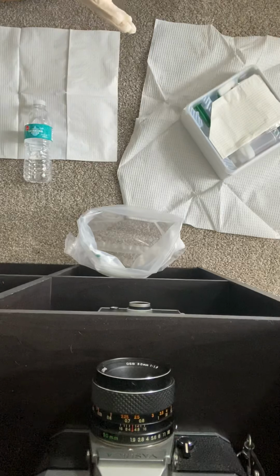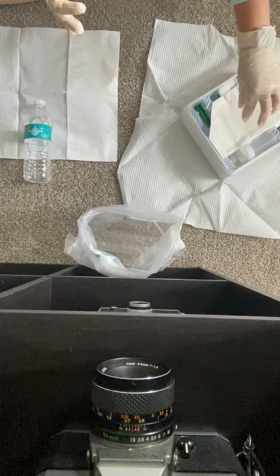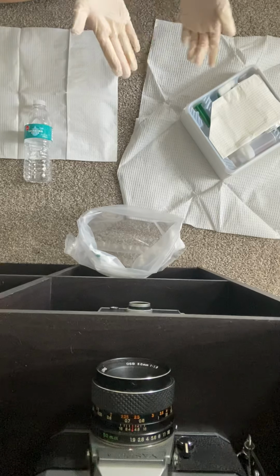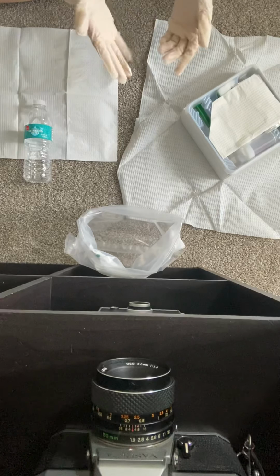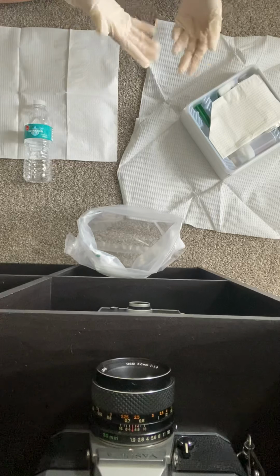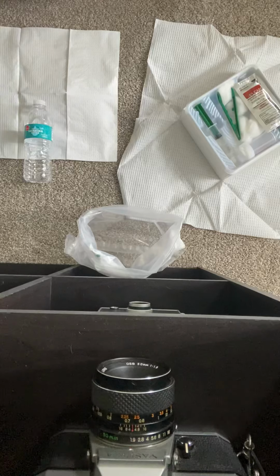So I'm just going to get rid of that. I'm not going to crumple that up and put it in the trash can because it's too much. This one, I honestly don't use this. I don't know if you want us to use it. Sometimes I do with the males more than the females, but since you have the sterile drape underneath, I don't feel like it's necessary to even use that. So I just take that out and throw that away.